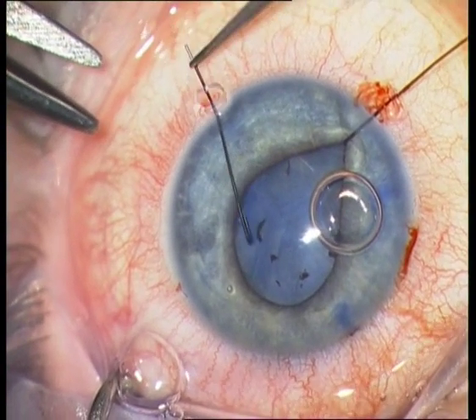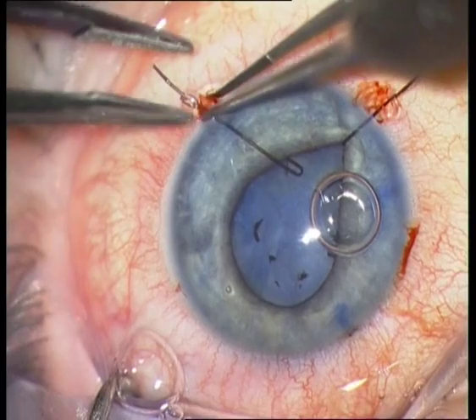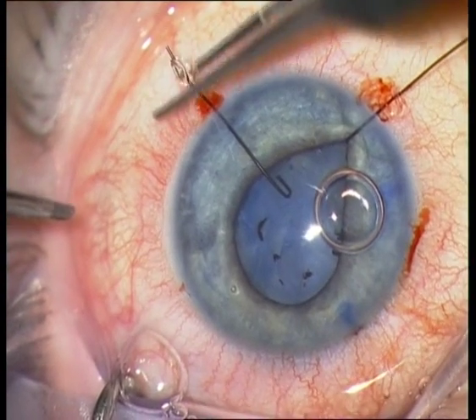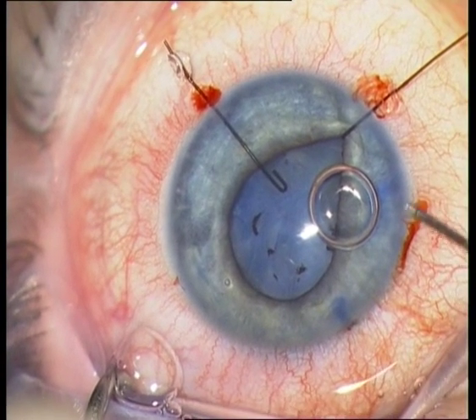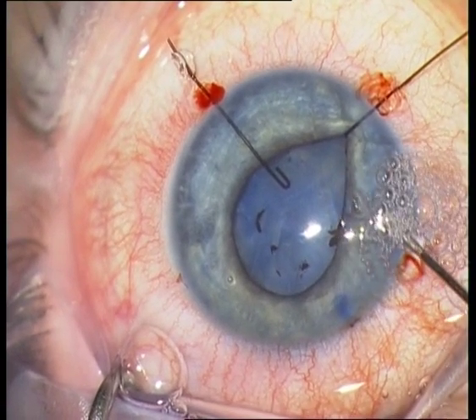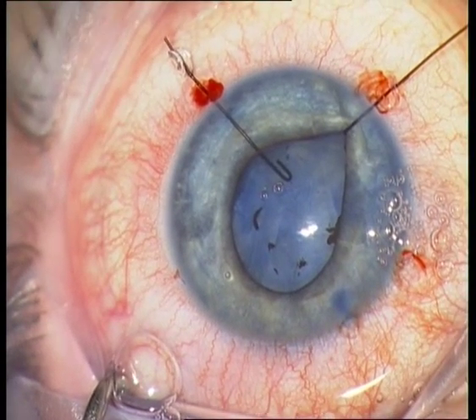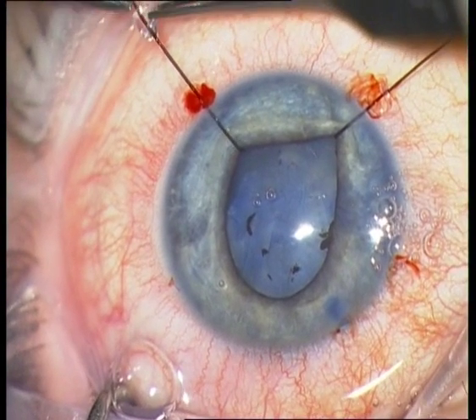I am just showing one small trick here. You see I do not succeed to place the hook under the iris, because there is no space between the iris and nucleus. The trick is to inject viscoelastics behind the iris so that you can place the hook in this gap. Very simple now.